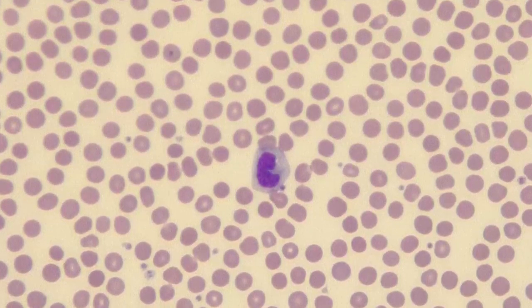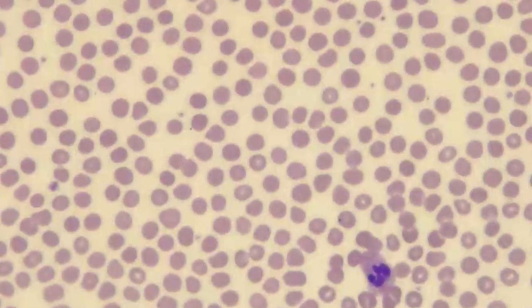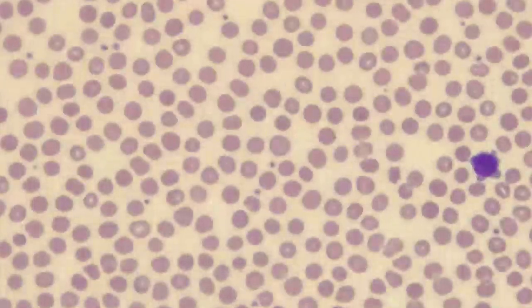Now, another thing that I would look for when it comes to judging cellular distribution is the platelets. When you're looking around, if you have good eyes on 10x, you can see if there's platelet clumping, meaning groups of platelets that are abnormally adhering to each other.